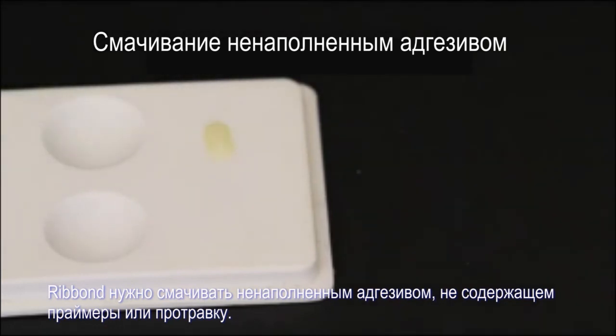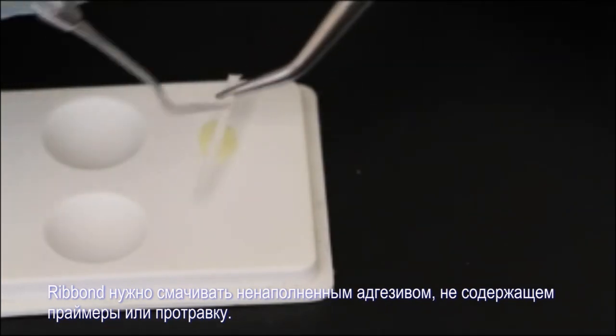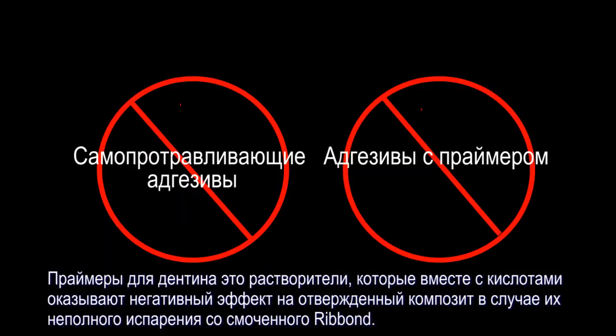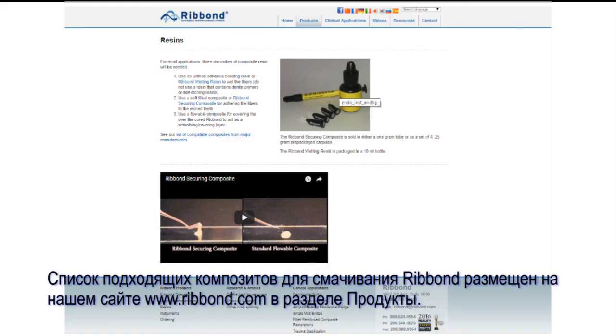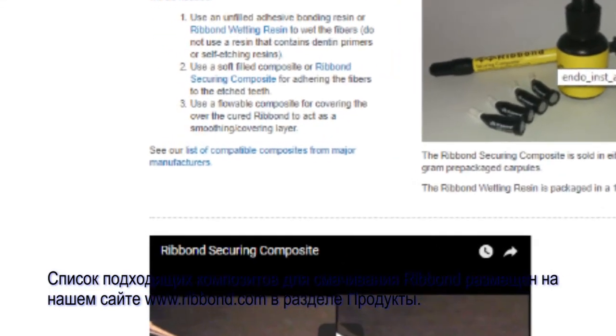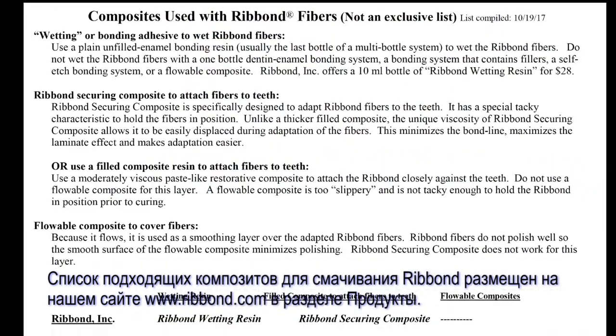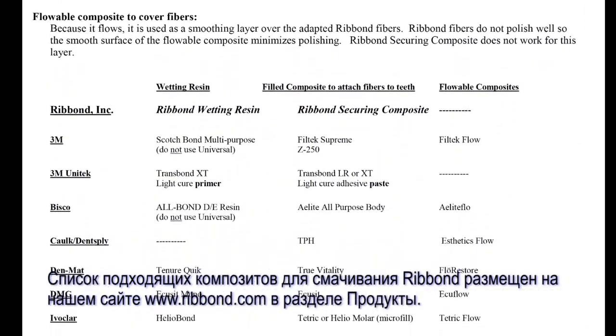What do I wet the Ribbond with? Wet the Ribbond with an unfilled bonding resin that does not contain a dentin primer or acid etchant. These added chemical components will have an adverse effect on the cured resin if not thoroughly evaporated from the wetted Ribbond. A list of suitable resins for wetting the Ribbond can be found at our website, www.ribbond.com — go to Products and then click on Resins.